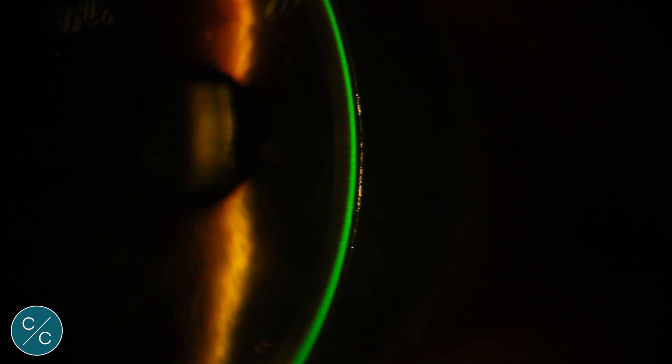Okay, we'll now look at the lens under the slit lamp. Under white light we can see the front surface of the lens glistening there. The lens thickness is 350 microns, which shows us that the tear layer stained green by the fluorescent is also approximately 350 microns. Just behind it faintly you can see the cornea, which is about 550 microns. So this is ideal.